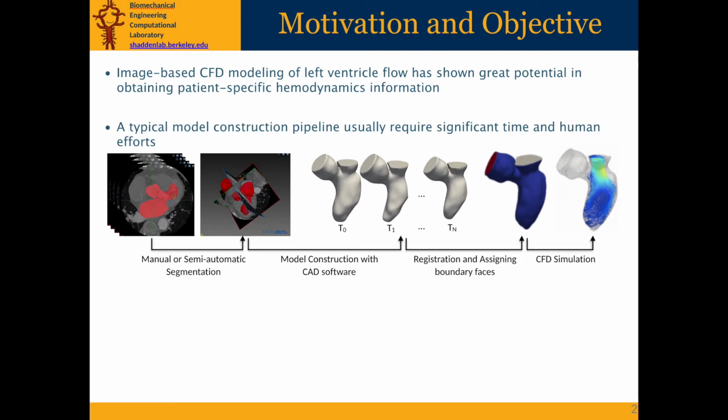assessment of the heart. A typical model construction pipeline starts with segmentation of the LV by manual delineation, followed by mesh generation and registration techniques using separate software tools. However, such approaches usually require significant time and human efforts, limiting large-scale analysis.